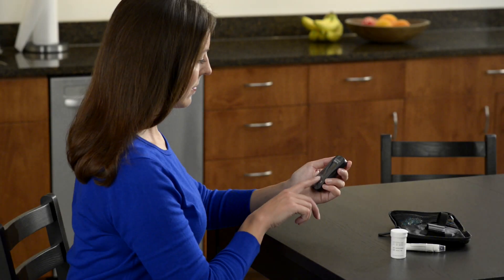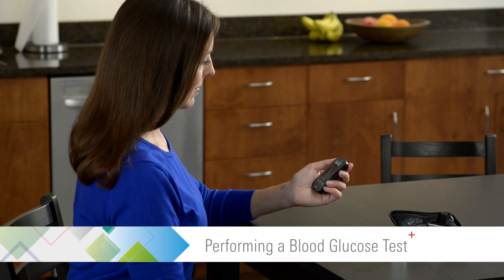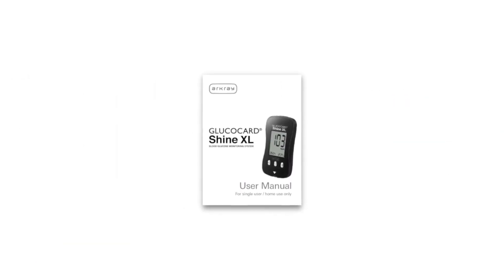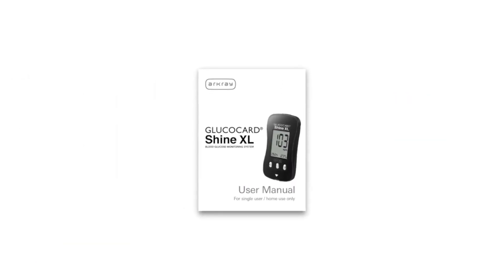This video provides an overview on how to perform a blood glucose test with the Glucocard Shine XL blood glucose monitoring system. For complete instructions, please see the user manual supplied with the meter.